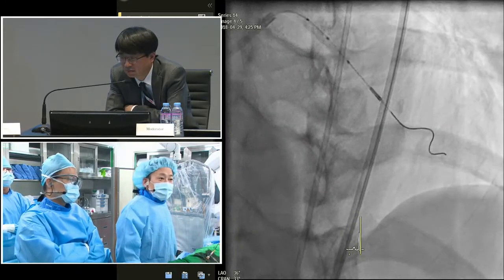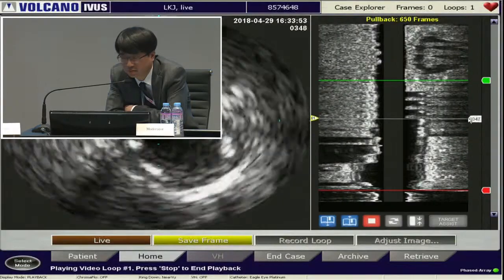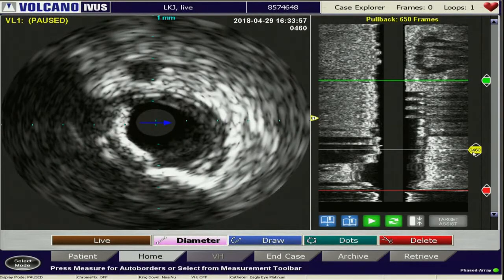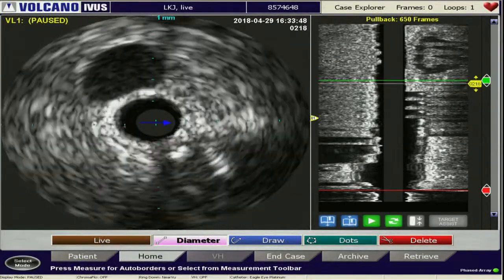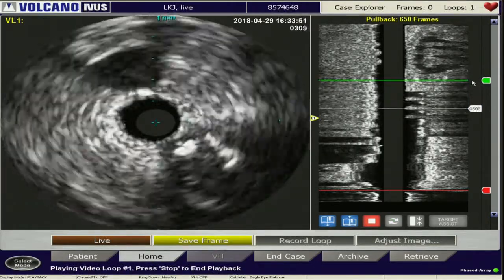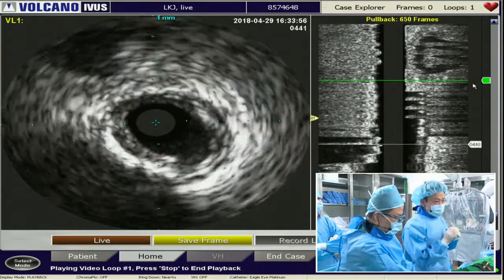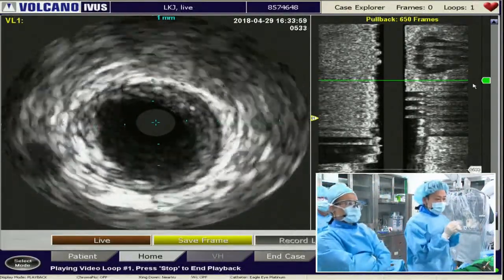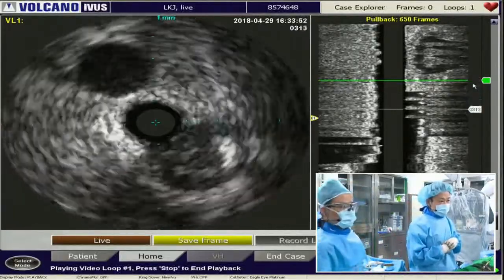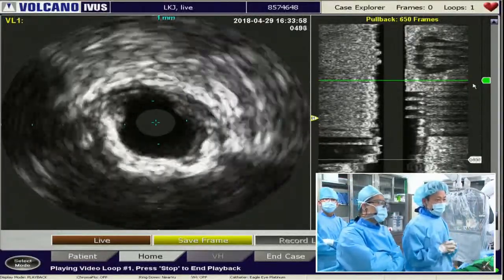Next, please. Okay, so could you change the screen for the IVUS? Please go back to the beginning. This is already LAD. So this is the diagonal, okay. Please play. We can see some calcification, but IVUS-guided puncture is very difficult because the actual occluded proximal cap is a little bit far, and also the lumen is very big and the vessel is very big. So it's very difficult to see and to use the IVUS for the puncture in this kind of situation, I guess.